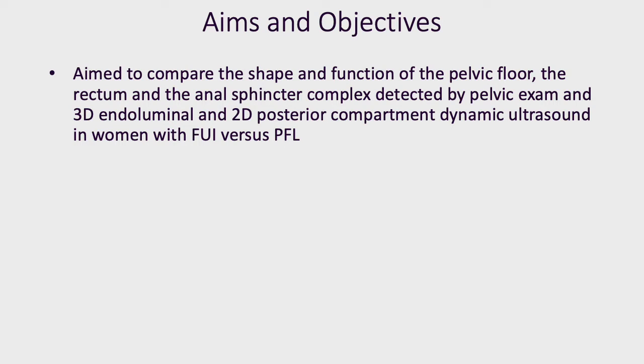We sought to use pelvic floor ultrasonography with both 3D and dynamic elements to further investigate the anatomic parameters in these two clinical subtypes of fecal incontinence.